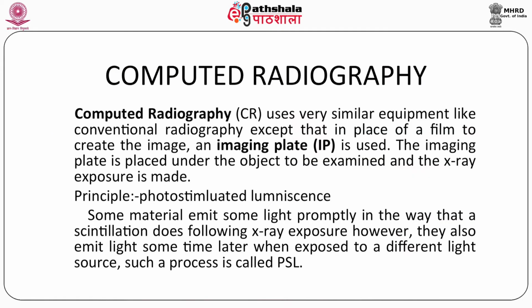Now coming to computed radiography, it is a computer based radiography, a digital way of doing general radiography with conventional X-ray machines. It refers to the projection of the X-ray image using a photostimulable phosphor plate, PSP plate.